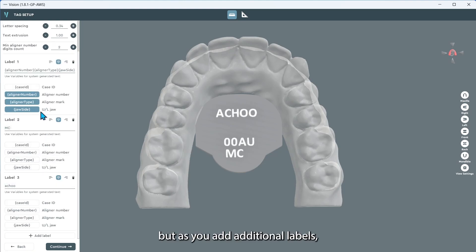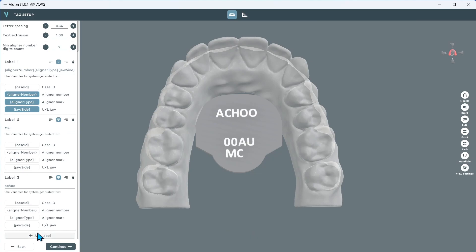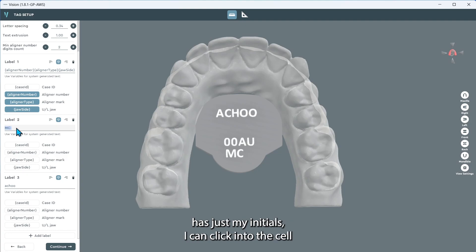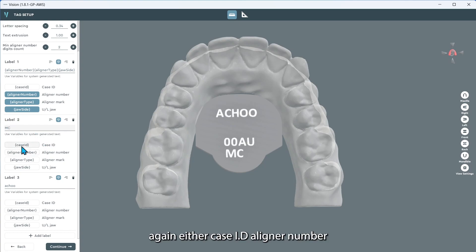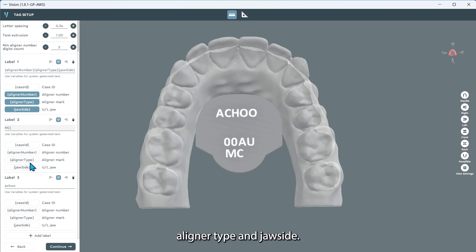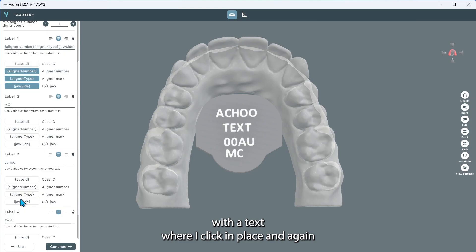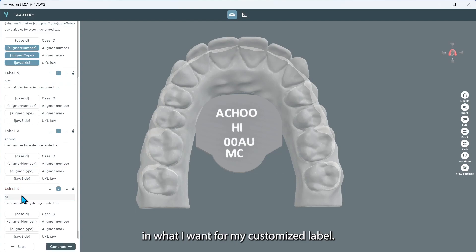I have a total of three labels, and as you add additional labels you'll see the option at the very bottom of the label you have at the beginning. You can continue to click add label in order to generate a new customized option. For example, label two might have just my initials — I can click into the cell and write what I want, and include again case ID, aligner number, aligner type, and jaw side. When creating a new label, you'll click on add label and you'll see the options show up with a text placeholder. You can delete that and type in what you want for your customized label.